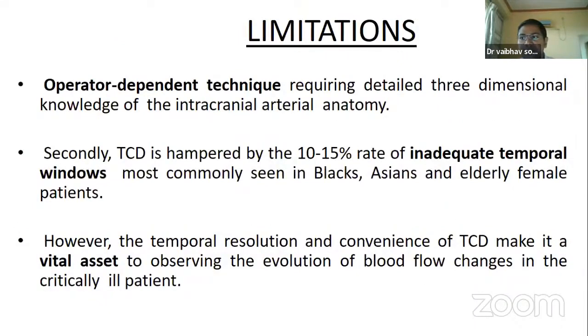Now, what are the limitations of this transcranial Doppler tool, because of which it is slightly underutilized among neurologists and radiologists? It is an operator-dependent technique requiring detailed 3-dimensional knowledge of intracranial artery anatomy. So the person performing this test should have complete 3-dimensional knowledge of the intracranial arterial anatomy. Secondly, TCD is hampered by a 10 to 15% rate of inadequate temporal window.